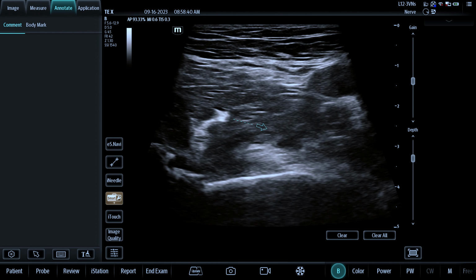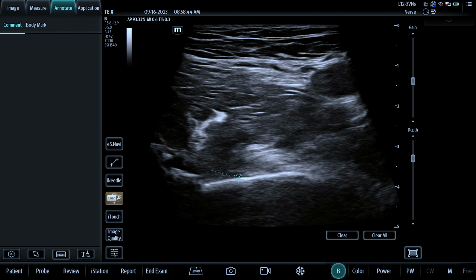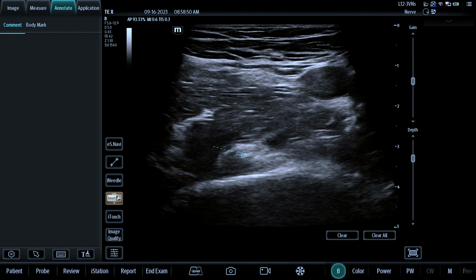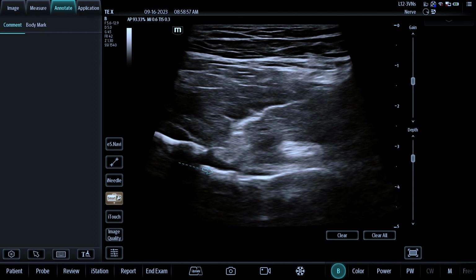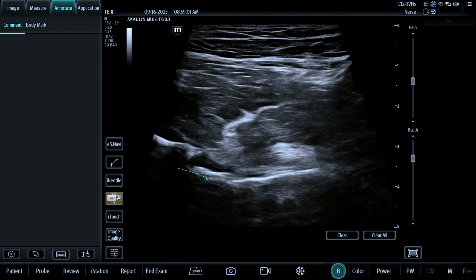this. Here we again have our femoral artery, femoral nerve, deep to this, and this little hump right here is the IPE, or iliopubic eminence. Just to the lateral aspect of the IPE, we see this nice hyperechoic structure, which is the psoas tendon. If I go a little bit more lateral, you'll see this nice bump here, which is also a bony structure.